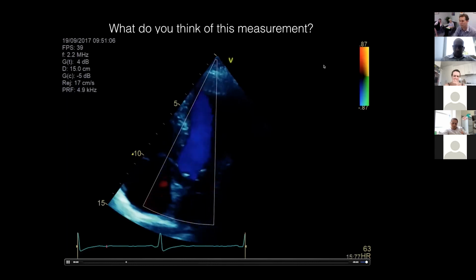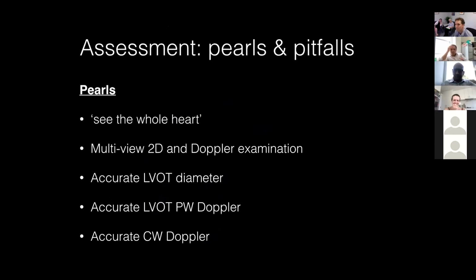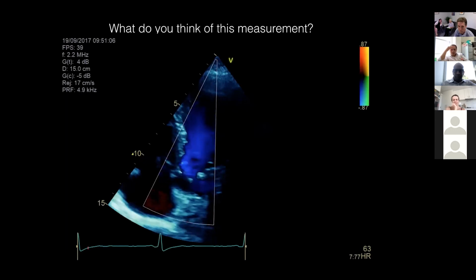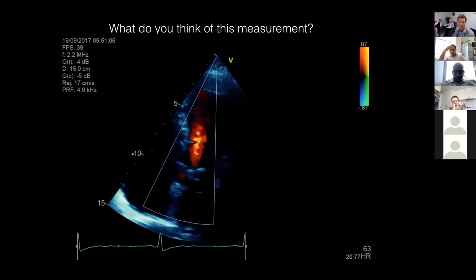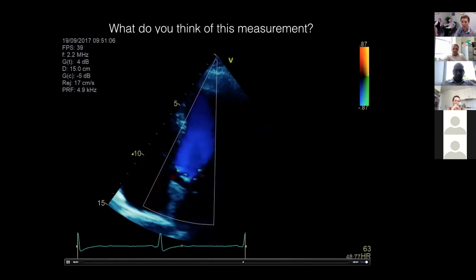I thought that was a pretty cool little tip and trick. And Sam, with the previous picture as well, it doesn't look like the systolic function is at its best. Yeah, really nice comment. That's brilliant. Yeah, I completely agree, it potentially could be a low flow state. Yeah. And we'll just come on to that right now, actually.